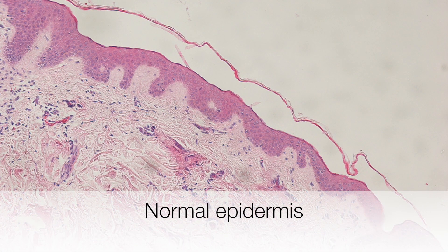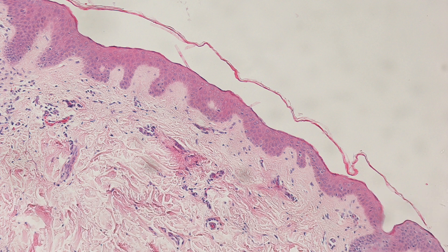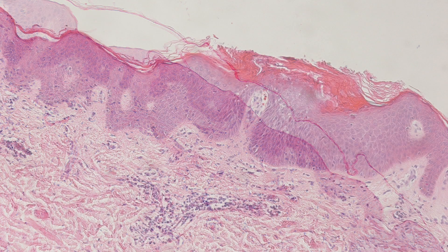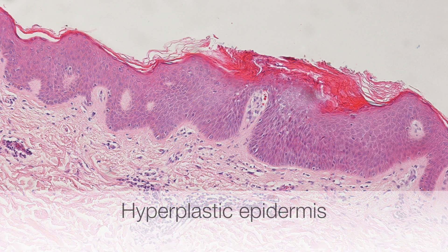This shows the epidermis at the edge of the biopsy away from the granular cell tumour, and the epidermis is thin and appears normal. But if we look at the epidermis directly above the granular cell tumour, it is clearly thickened and hyperplastic.